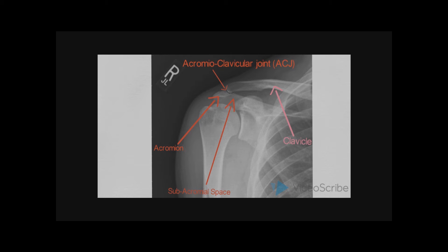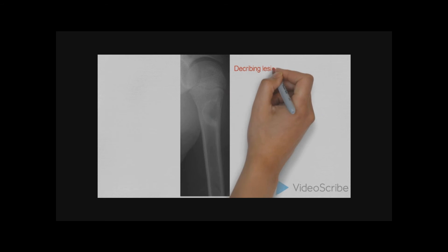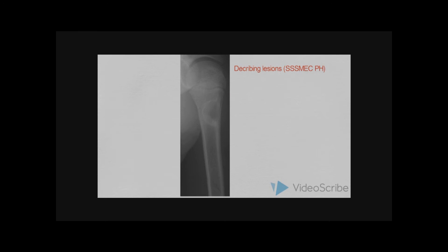We then move on to assessing the clavicle. When assessing the clavicle, we start at the articular surface of the acromioclavicular joint and follow the outlines of the body of the clavicle throughout. Once again, we are assessing for any periosteal reactions, any evidence of fractures, and any other abnormalities that may be present.